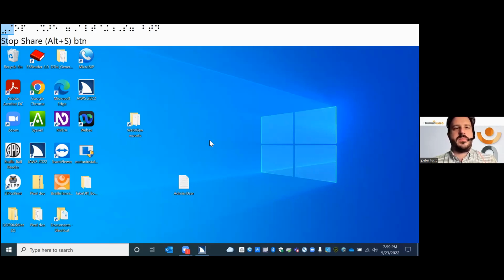So I have English, I have Spanish, Russian, just different things I've configured. But when I want to modify one of these, you can just press C for configure profile. You have a configure profile option listed below any profiles you may have.